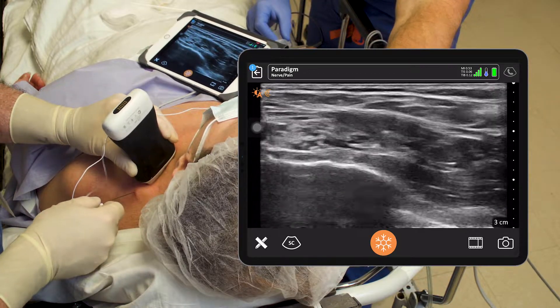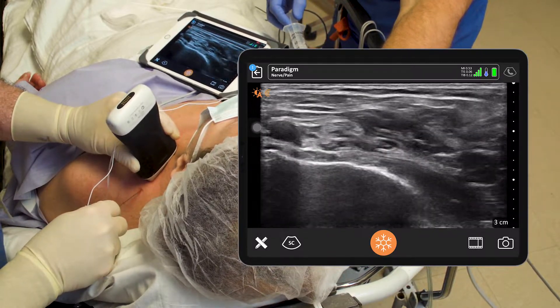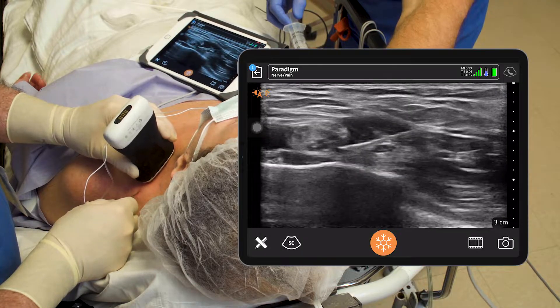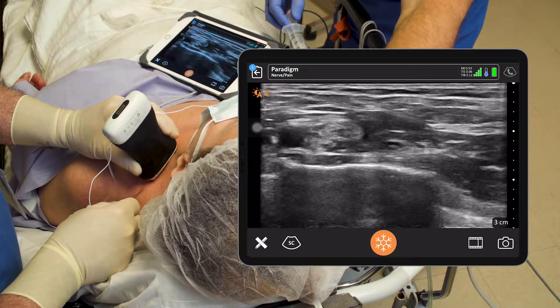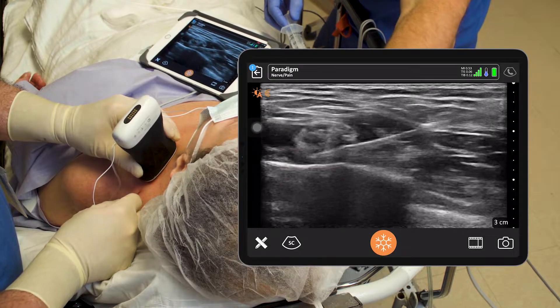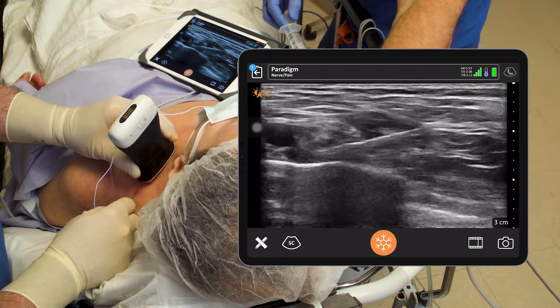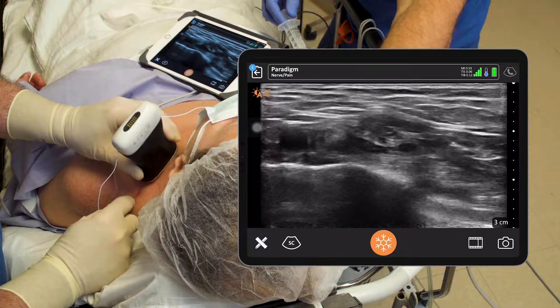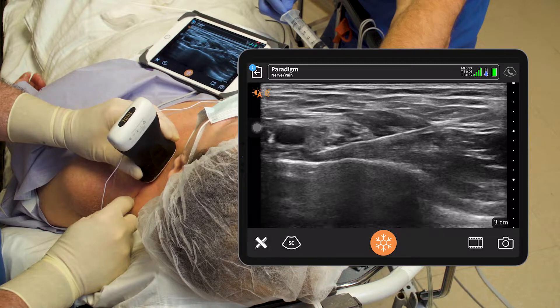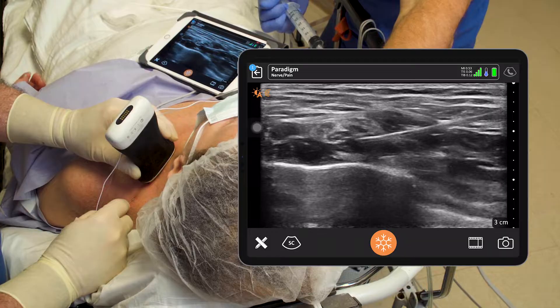Now we've got five left, so I'm going to go back down and finish off down in the corner pocket. Get my needle where I can see it — there's our needle. We're going to go right down underneath the nerves, between the nerves and the rib, get over close to the artery. Give our last five right here, Rocky — this will be a total of 30 CCs, quarter percent bupivacaine. Beautiful. And we'll pull back. Looking good.